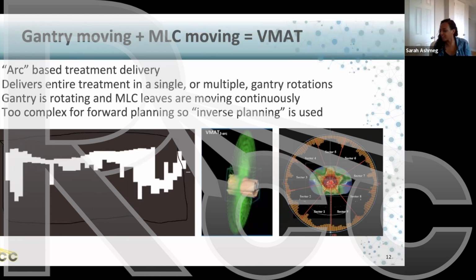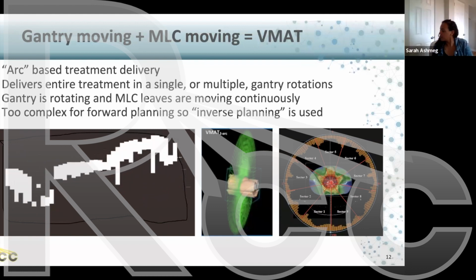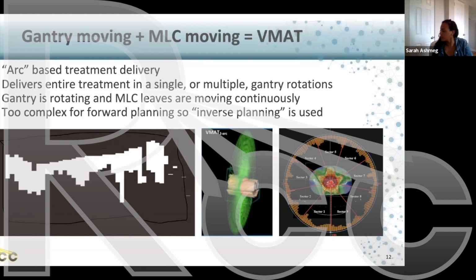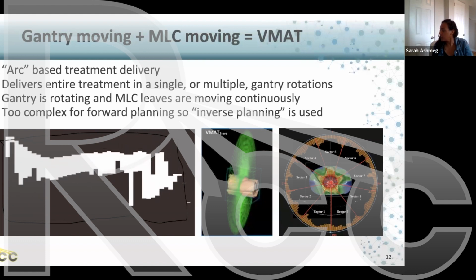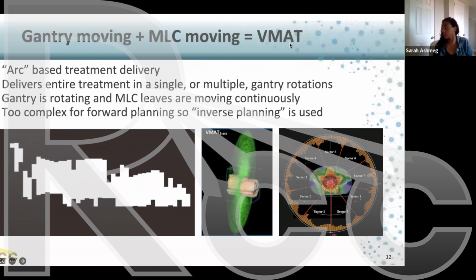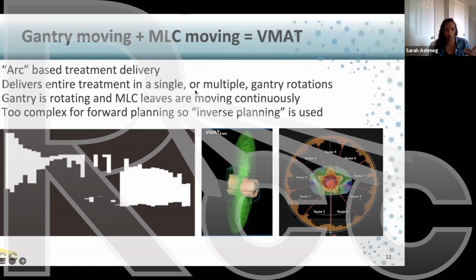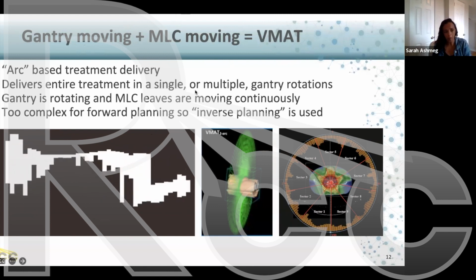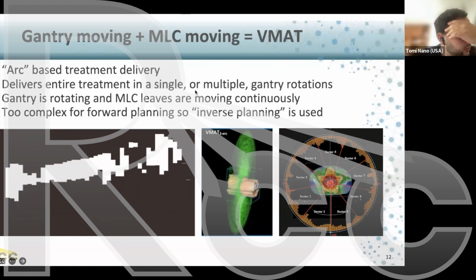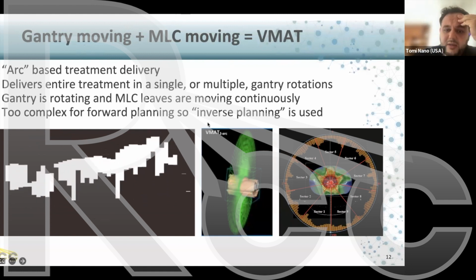Right. Yeah, definitely. Okay, another question is regarding patient-specific QA. Back to IMRT, they have a matrix phantom, and they would like to do a QA for a large PTV, and they're asking how they can do that. Basically, they split the field and then shift the phantom, I guess. Is Matrix Sun Nuclear? I can't remember.